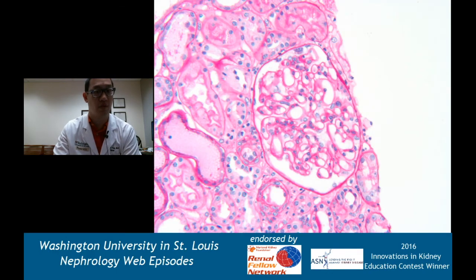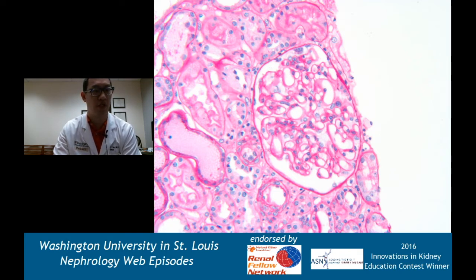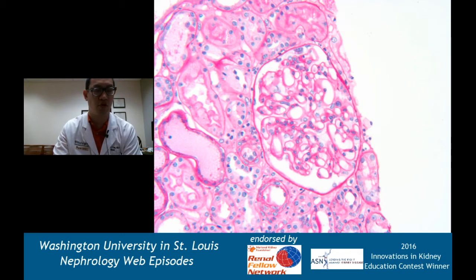Not all glomeruli showed that. Here's another glomerulus from the exact same kidney biopsy, also a PAS stain. You can see the Bowman's capsule and the tubular epithelium light up nicely with the PAS. This glomerulus looks pretty normal - open loops, healthy mesangium, no crescents, no fibrinoid necrosis. So what we have is focal areas of crescents.